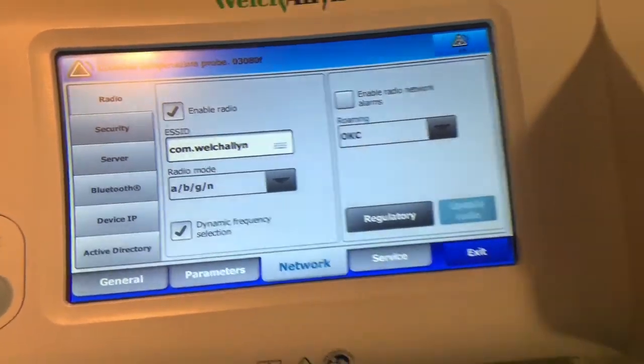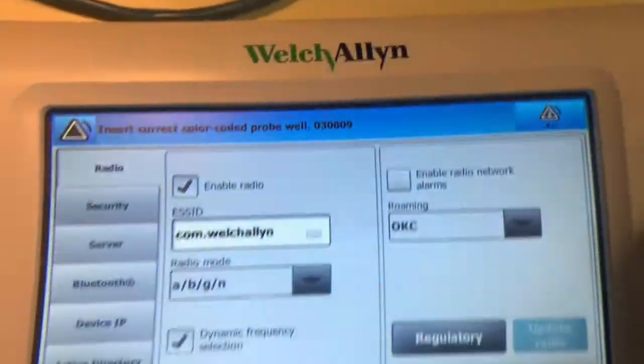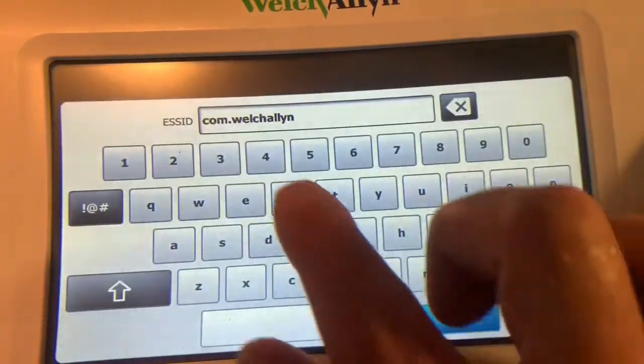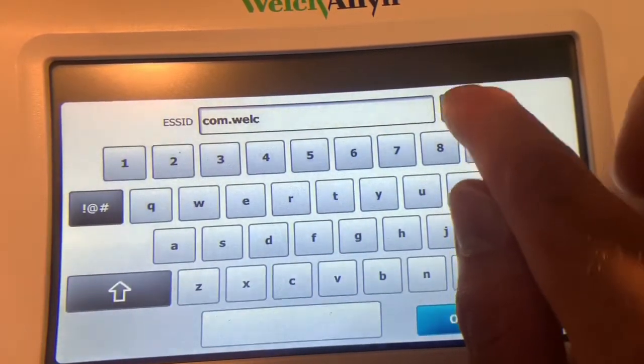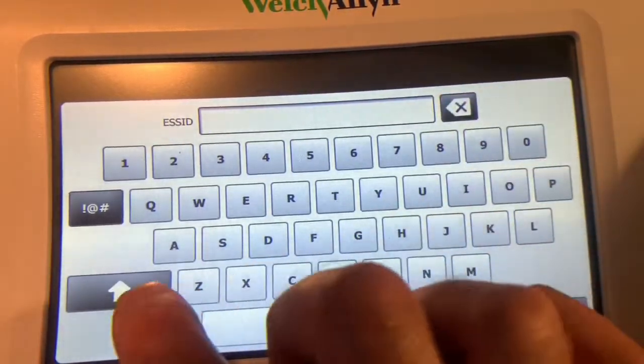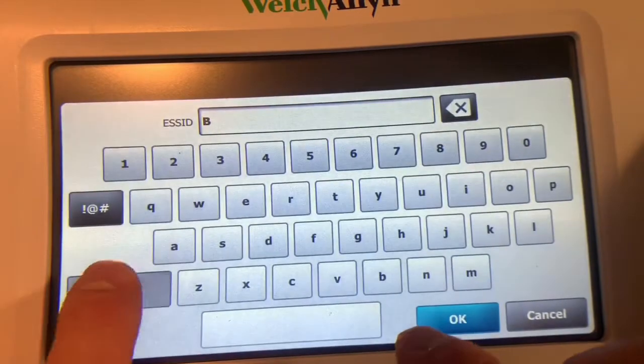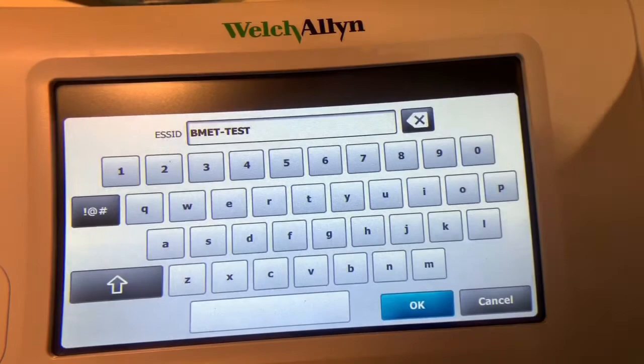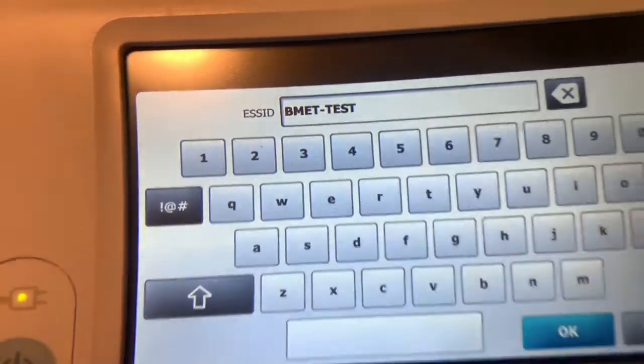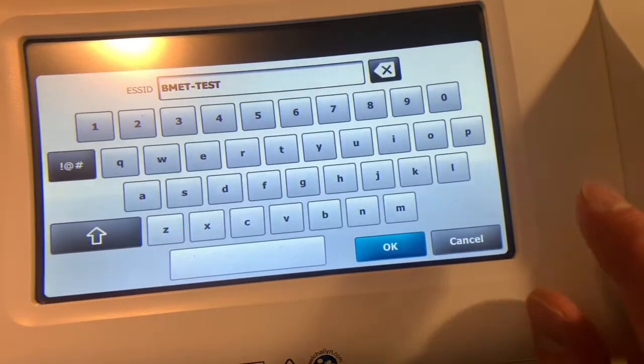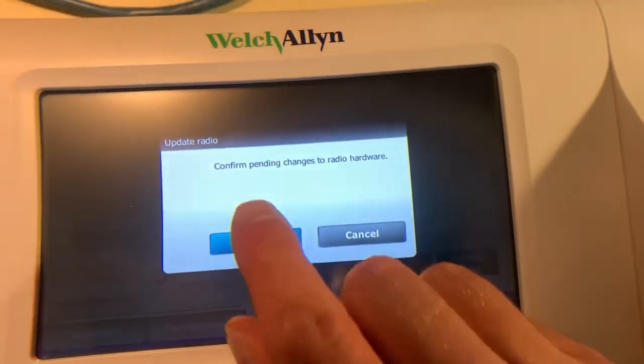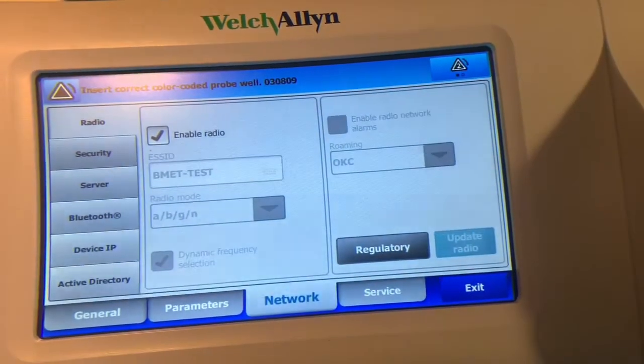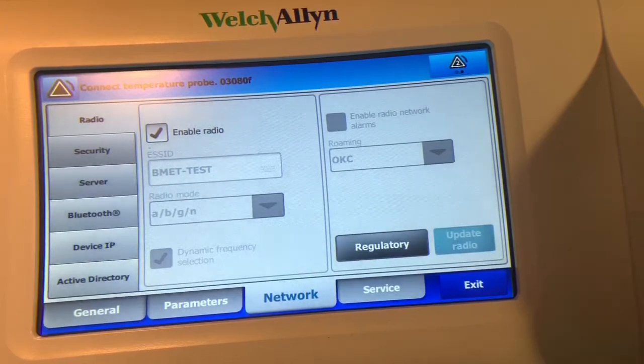So what I'm going to do instead is connect it to my simple little home router here, which I already know the network name of. So I'll click on there, and I will erase the default name for whatever that particular name is for, and enter in the network name of that router over there. So I've entered in the network name for this, which I just named BMET-test. That matches the network name on the router. Click okay. And you want to click update radio. Click okay for that. And it's going to try and associate with the wireless access point over here.